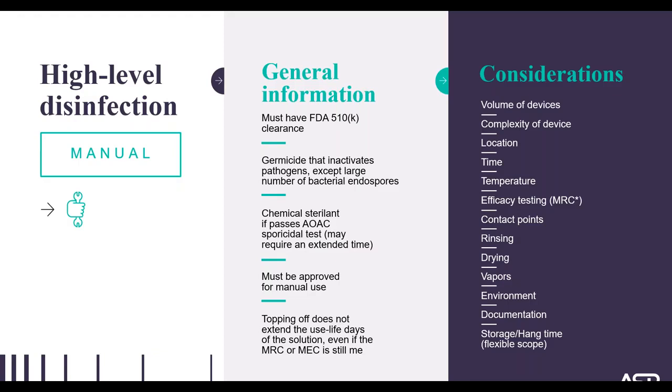Number one, there are no automated steps. And two, every step is dependent on the technician completing the steps correctly. So it's very subjective. Some of the challenges that I have personally seen are proper testing of the high-level disinfection solution, maintaining the high-level disinfection solution at the correct temperature, proper rinsing, and if you don't properly rinse, the chemical stays on that device, and then the patient is exposed to it, and they can actually have an adverse reaction to it.